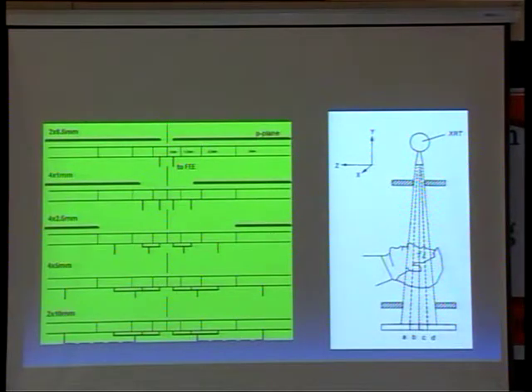From here you will have a better perspective. This is the distance between 2 collimators. Assume this is a source. This is the distance between 2 collimators. We keep on increasing our distance. See what's happening.